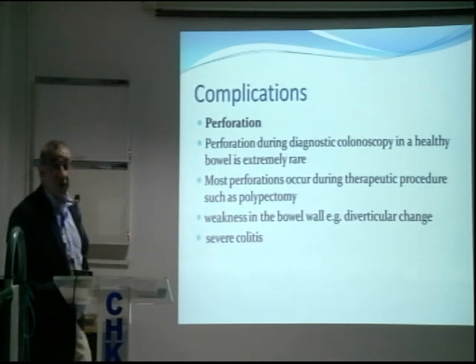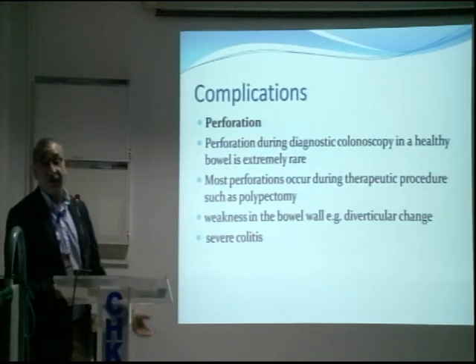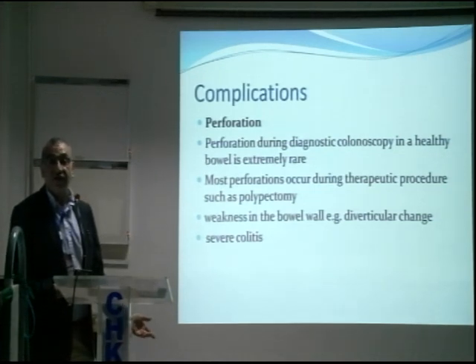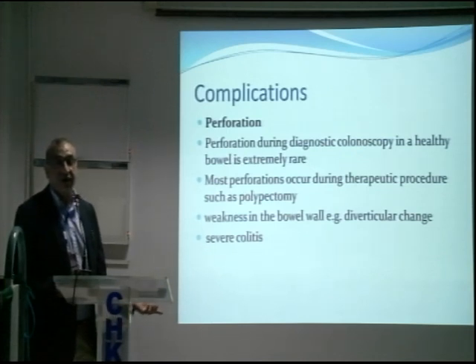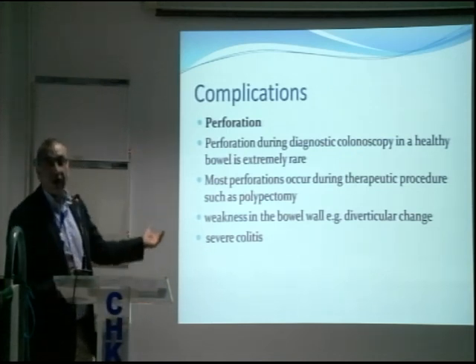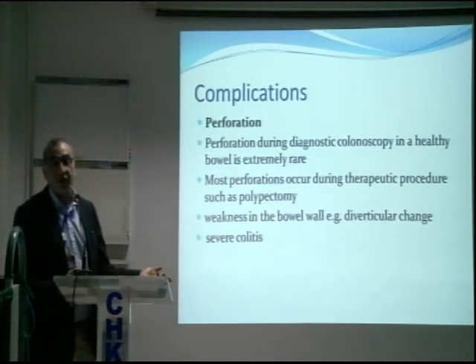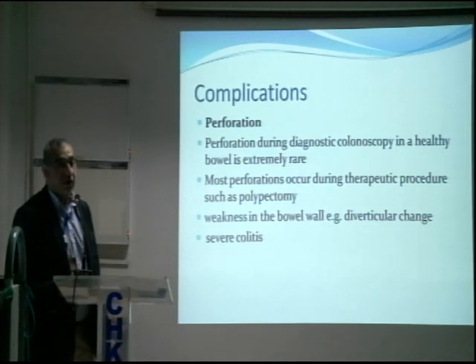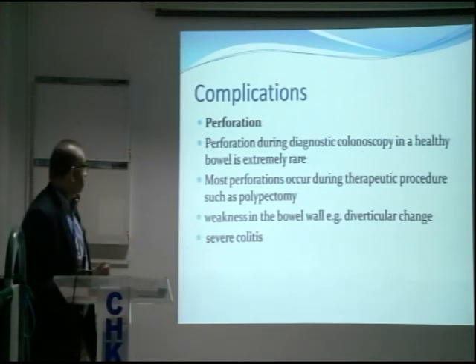Perforation during diagnostic colonoscopy, as I mentioned earlier, is extremely rare. If you cause it, you are doing something seriously wrong. Your technique is bad, or you've done something very, you know, stupid. So it shouldn't happen. In a therapeutic procedure, it is possible, and it's a well-recognized complication. But again, whenever we carry out any procedure, the first thing is try and do no harm.